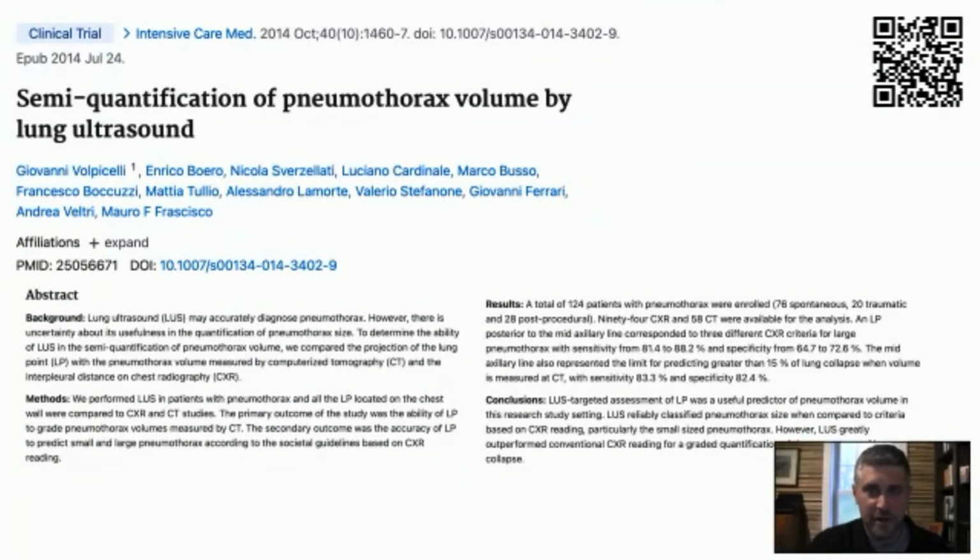Where you have that lung point, send them through the scanner and see if it correlates. And lo and behold, if you manually mark off, either in your head or on the patients, where the pneumo stops and CT them, they do correlate, right? And it makes sense, right? The pathology is just being visualized with two different imaging modalities. And so we can really use ultrasound to quantify.